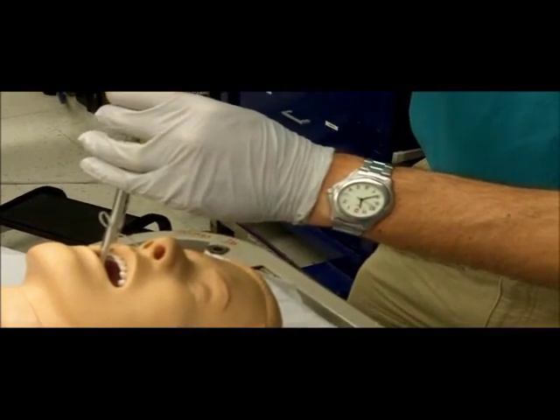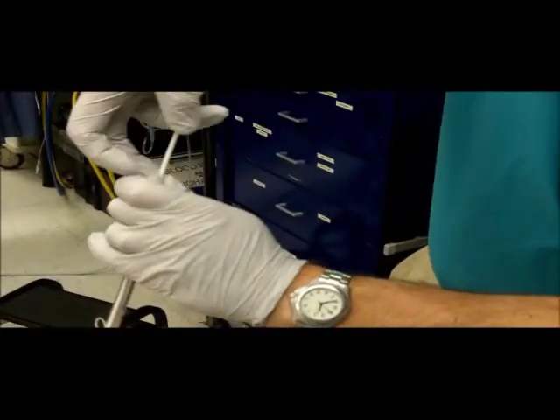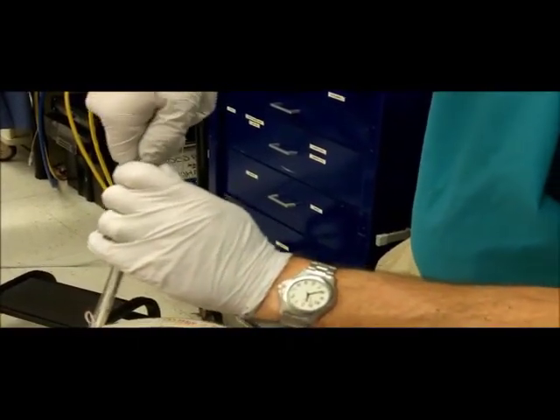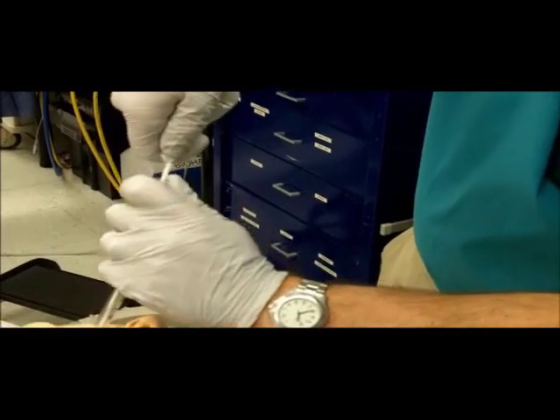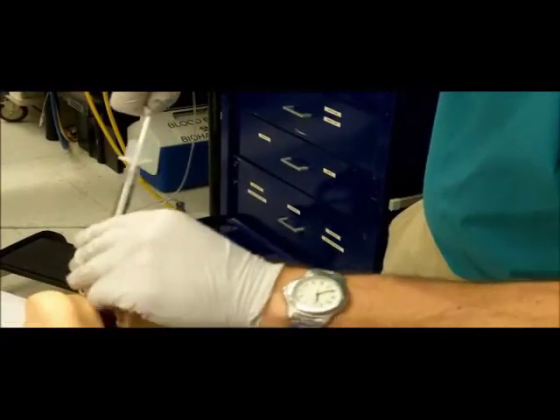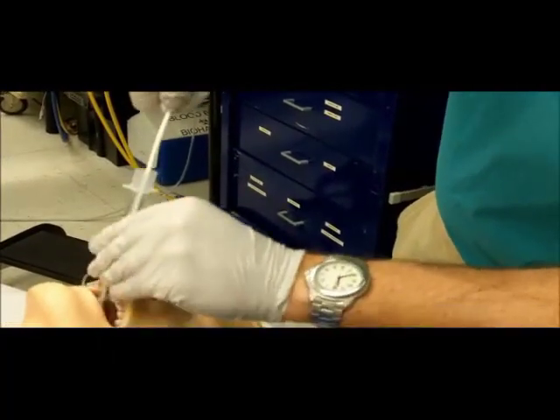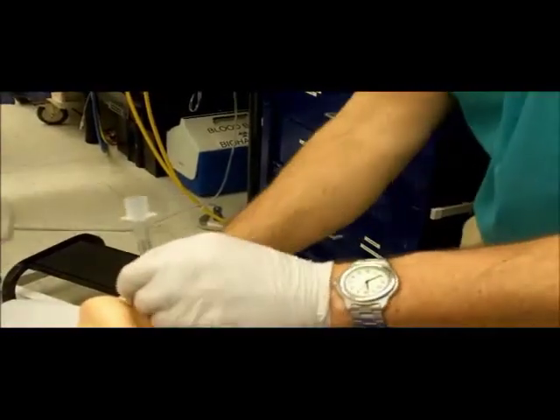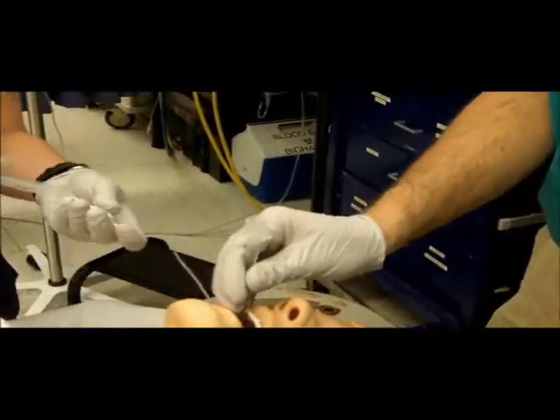Unlock the endotracheal tube connector from the device. Retract the rigid stylet while advancing the endotracheal tube. Inflate the cuff and confirm tube placement.